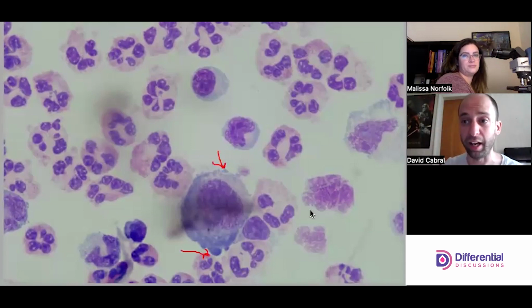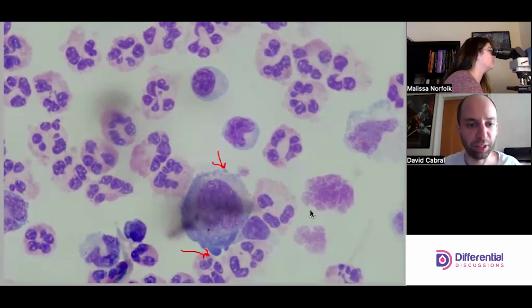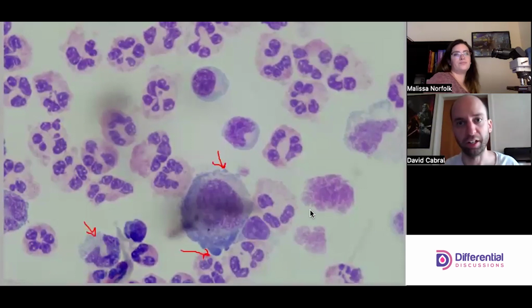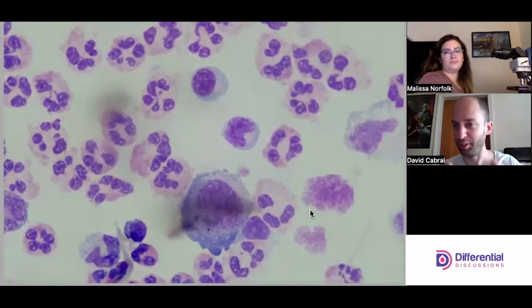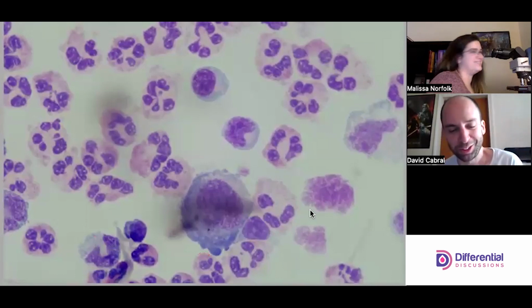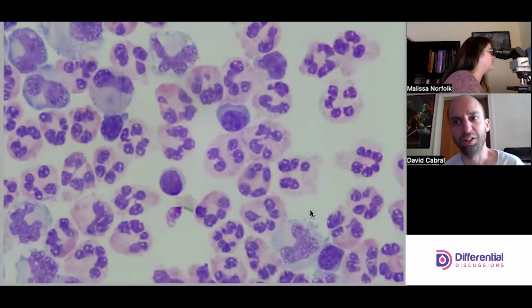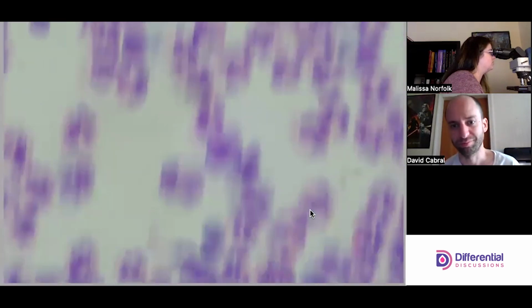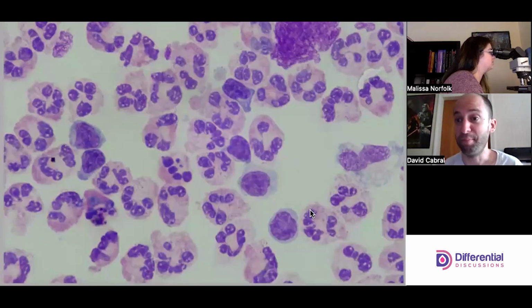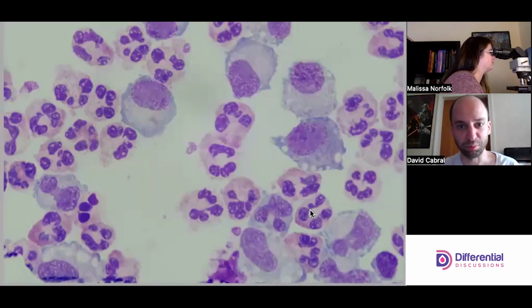And then the color that I talked about: it's got a deeper, richer blue coloration to the cytoplasm, because we can see there are some monos in the field here, with a much grayer, lighter color on the cytoplasm. So yeah, I believe that's probably one of the few synovial sites on the smear. We'll have other smears that will have more, hopefully not covered totally by mysterious dark objects. Some might have a ton. There might be a lot of lining cells in a given smear.